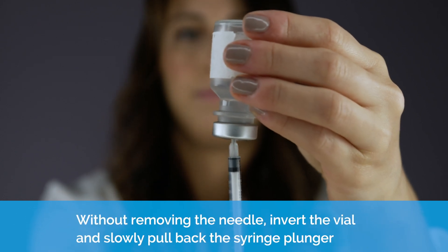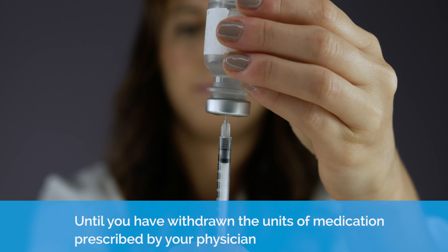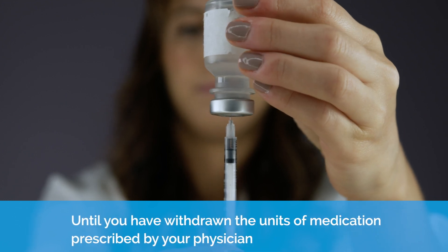Without removing the needle, invert the vial and slowly pull back the syringe plunger until you have withdrawn the units of medication prescribed by your physician.